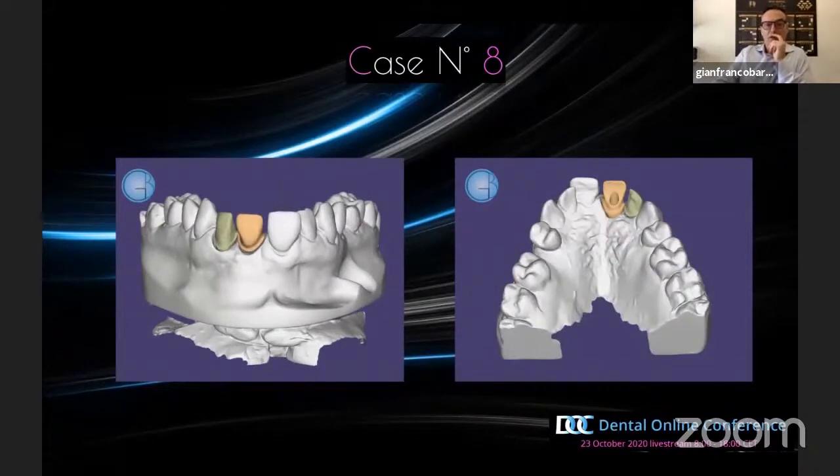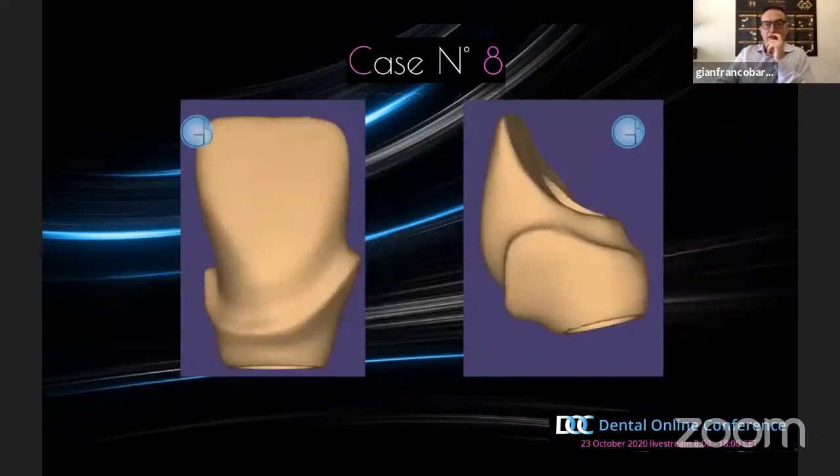After this, create the crown and the crown abutment in zirconia, and in this way, I repeat, we can manage the emergence profile properly. That's what helps to create a natural aspect, a natural emergence, and durability of the soft tissue around this restoration.